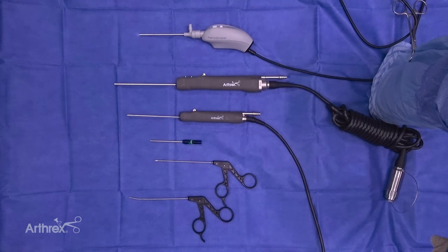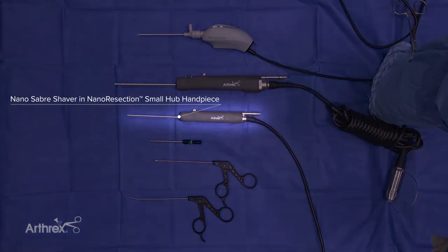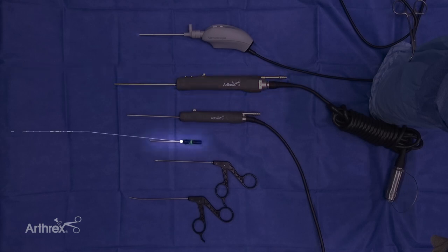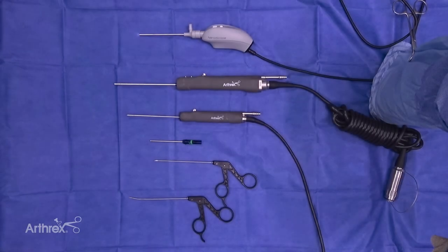I want to take some time today to introduce some new products in the Nano Arthroscopy line. In particular, I want to talk about this new 2.8mm x 11cm Nano Sabre shaver that fits on this small hub handle. I want to compare that to the 4mm x 13cm standard shaver, as well as the 3mm x 7cm short handle dex shaver. You can see that the length is intermediate between the two.